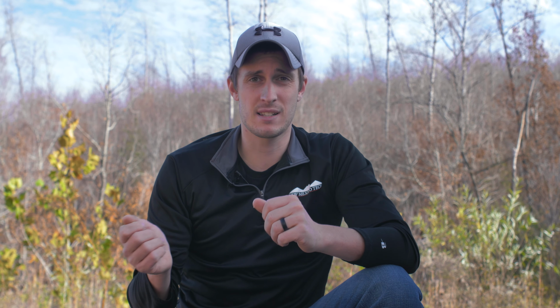I've got one that I've got in an oven right now. It's at 120 degrees. We're gonna pull that one out and apply it immediately and see if there's any difference after it's been sitting in a car. So simulating that it's 100 degrees outside, the car's even hotter than that. Let's say it's 120, we pull that out, stick it on there. Let's see if that changes anything. Second, we are going to wet this dummy a little bit and see how well these stick with some water applied as well.